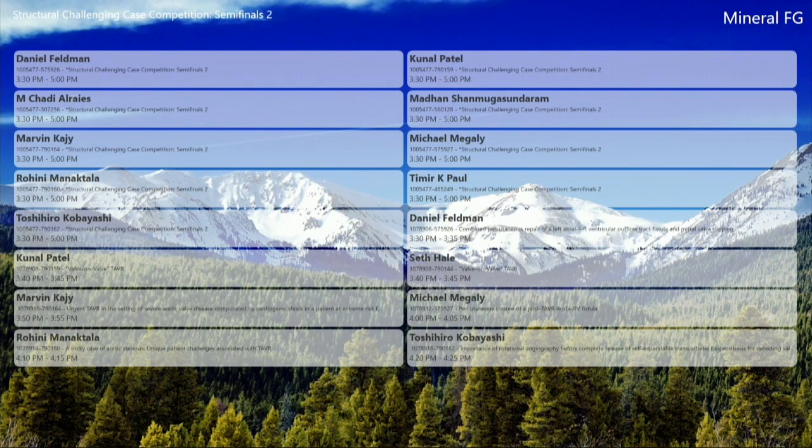Have you ever seen this before in any of your other cases? Yes, in 200 to 300 cases in my experience, I have only one case. During proctoring in Japan, I had a similar case. But unfortunately, the infolding can only be identified after the deployment of the THV. So we can see the massive regurgitation and the valve is folded inside. So post-dilatation is relatively effective, but the regurgitation still remains and some valve deformation still remains. That's a good point. Have you tried dilating with the balloon just after you explant, after you take that out? Okay.